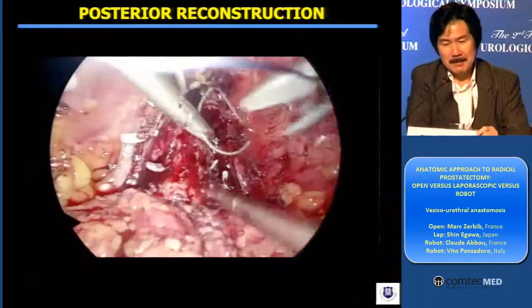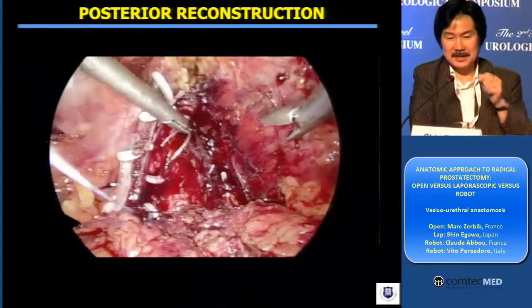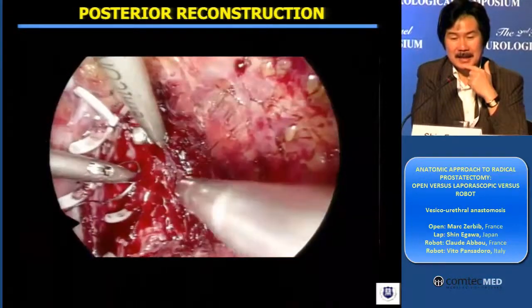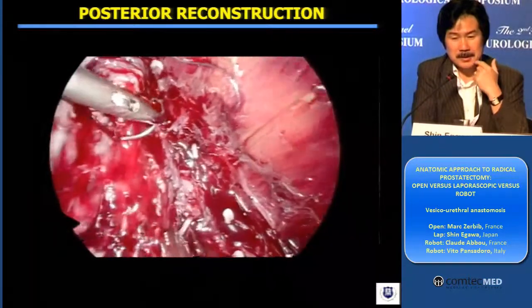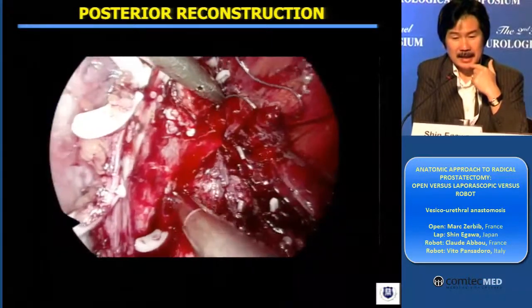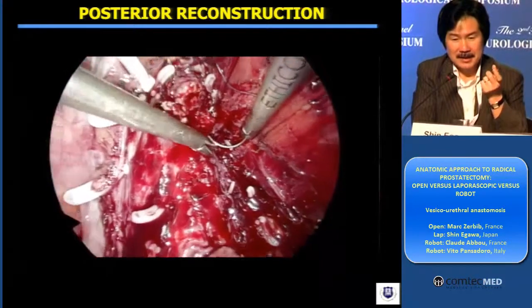This clip may be relevant since I was asked to illustrate the way I do anastomosis. This is a part of the posterior — so-called posterior reconstruction — and I bite the median raphe, just one bite.